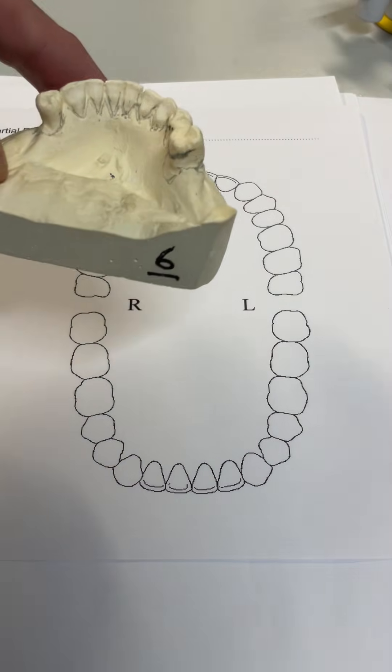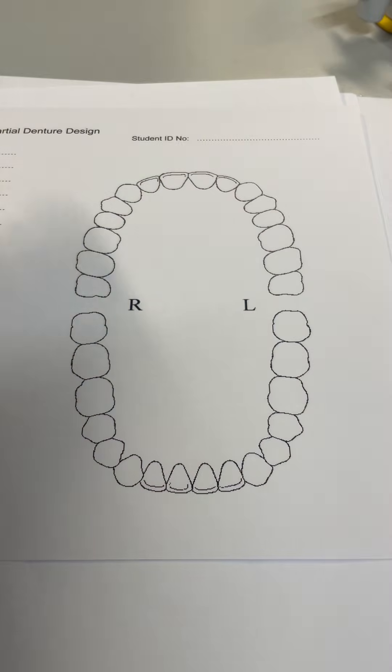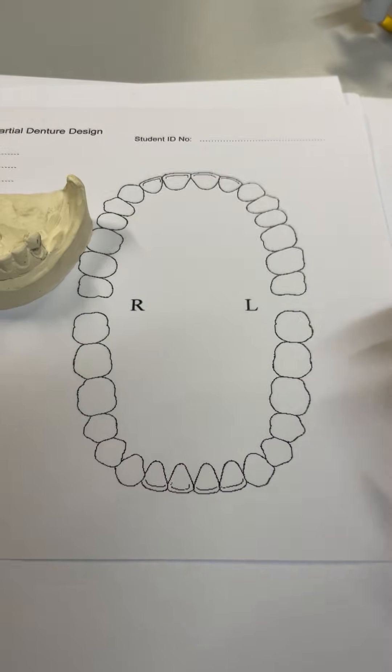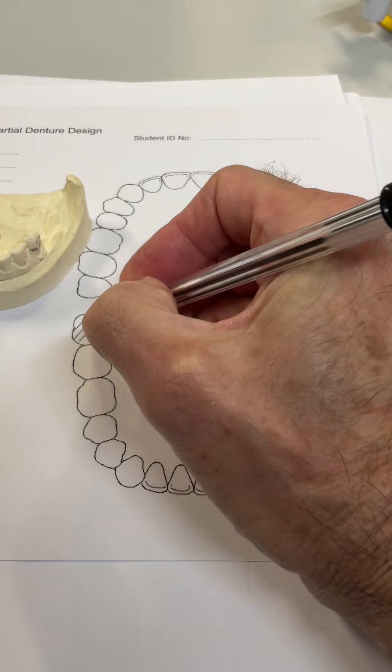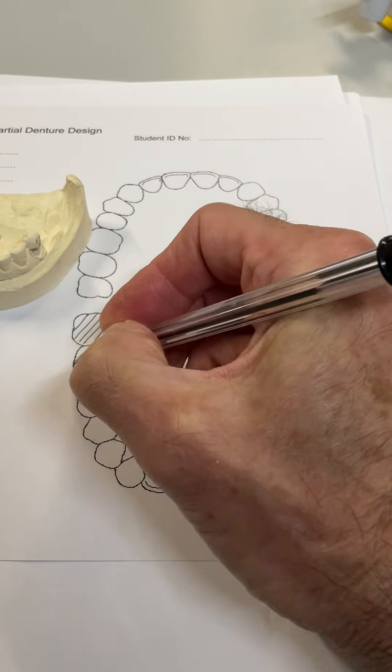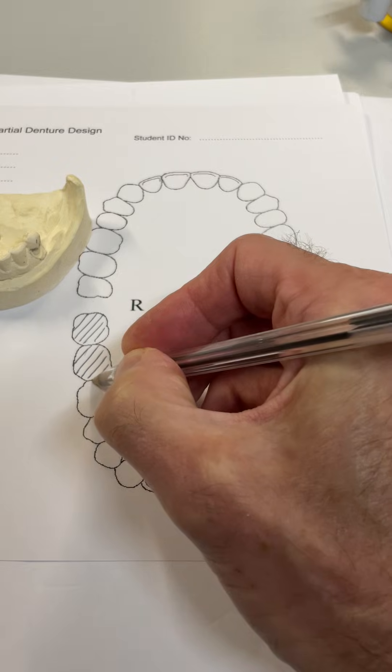Case number six: bilateral free-end saddle. The first thing we do, as you know, is to hash out the missing teeth. Lower right we have no molars. We're not going to replace the eights, but we're still going to shade out the area because the denture base is going to go back as far as the retromolar pad.